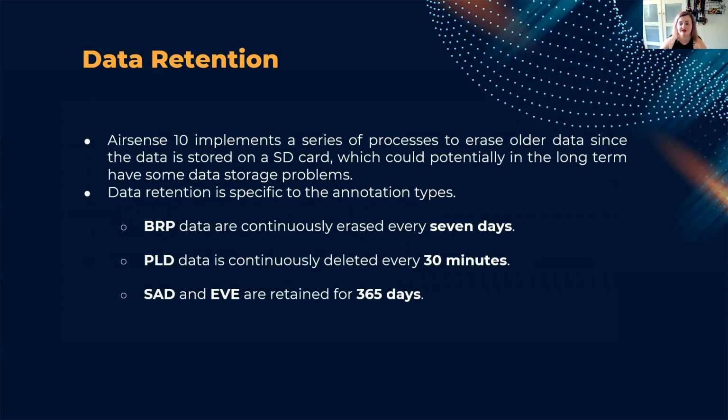Now, another interesting thing that I wanted to look at is, well, what happens if I actually factory reset the device? How's the data retained? The AirSense 10 has multiple processes that it goes through to erase all data, and it has some data retention policies in place. It kind of looks like it is just a high level format. So what I did was back up my dad's data, factory reset the device, and then look at whether or not I can actually recover some data.